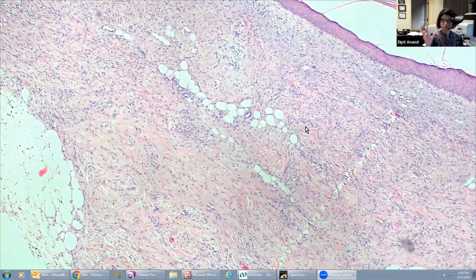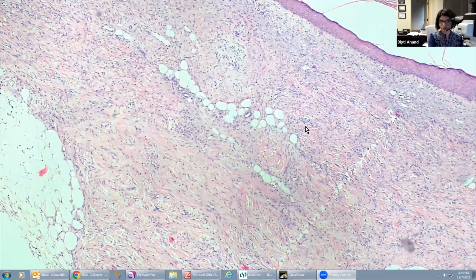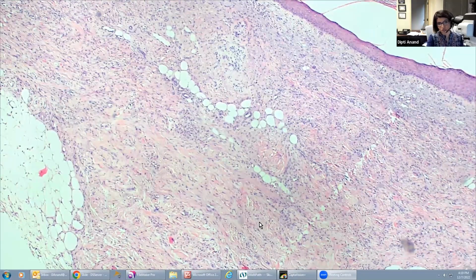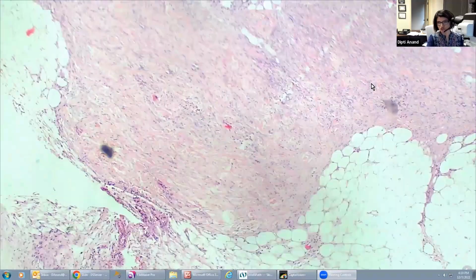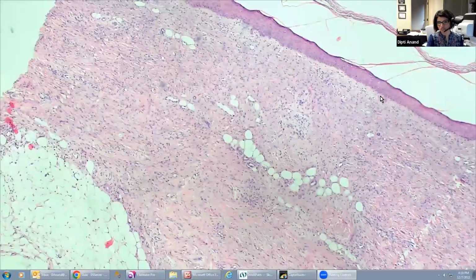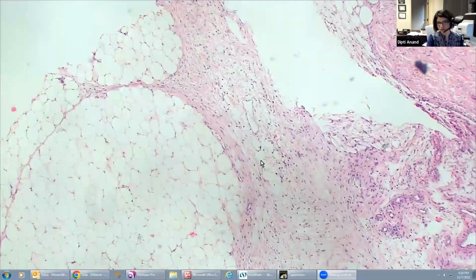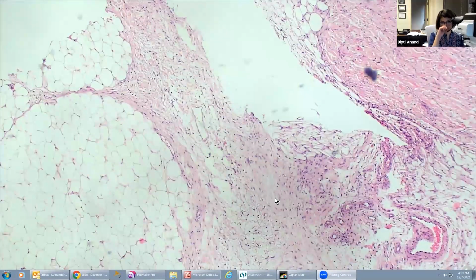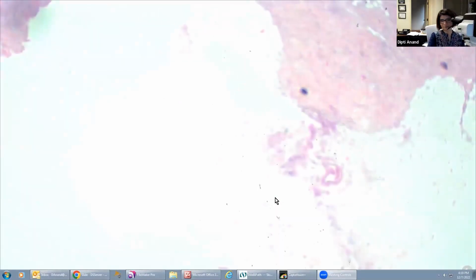Now, the upper portion of nephrogenic systemic fibrosis and scleromyxedema can look really similar. But nephrogenic systemic fibrosis is a much more deep-seated process. So unlike scleromyxedema, which is just in the upper and the mid dermis, nephrogenic systemic fibrosis will go around into the subcutaneous fat presenting with septal fibrosis and thickening. So remember when we were talking about septal panniculitis, one of the causes of a septal panniculitis other than erythema nodosum is nephrogenic systemic fibrosis. That's because it trails down the septa.